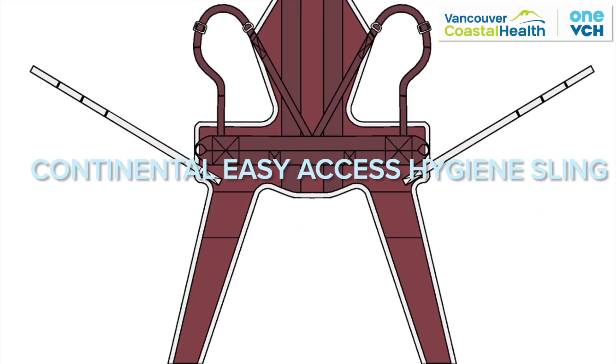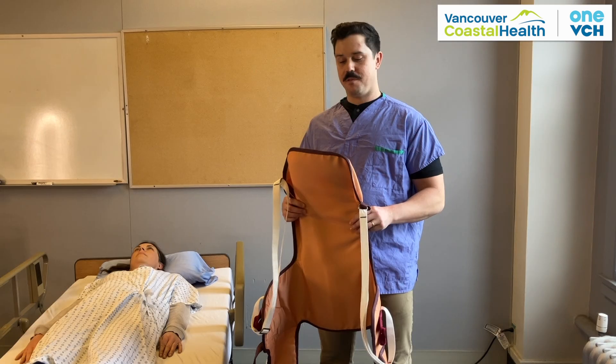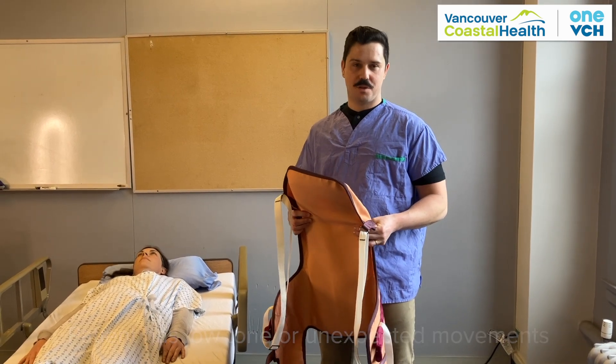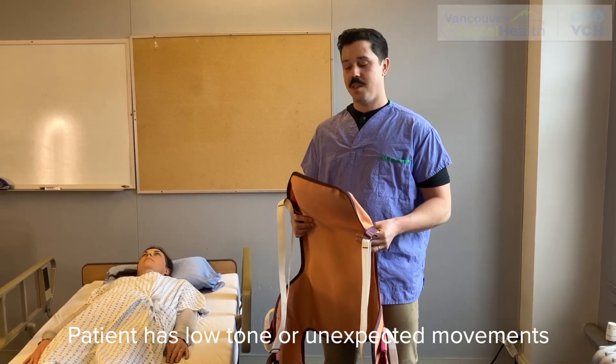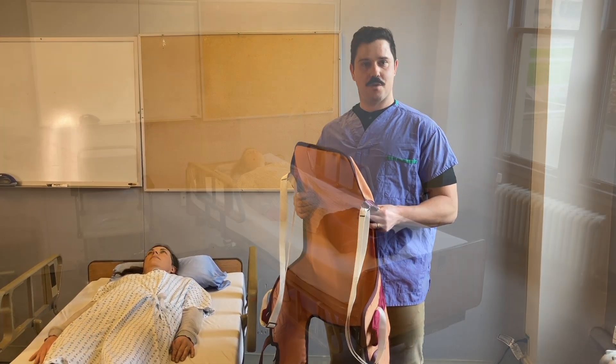This video shows you how to use the Continental Easy Access Hygiene Sling. If your patient may benefit from a hygiene sling but may have low tone or sudden unexpected movements, it may benefit from a Continental Easy Access Sling which has more trunk support.